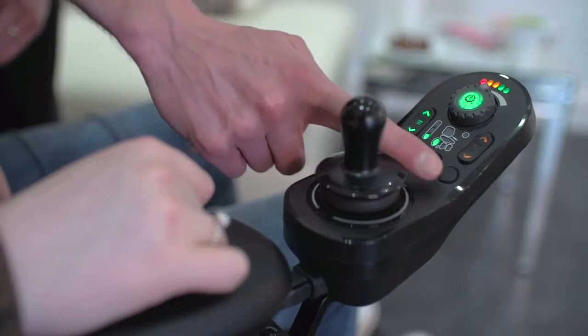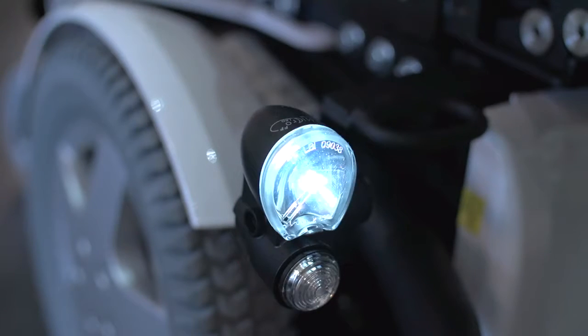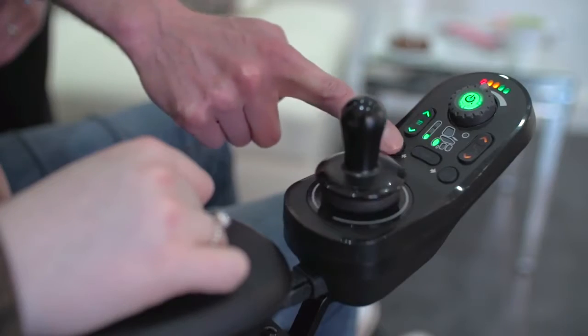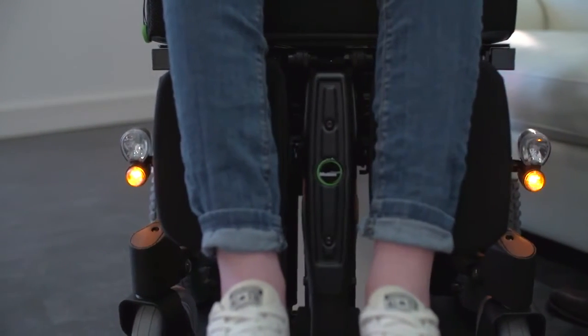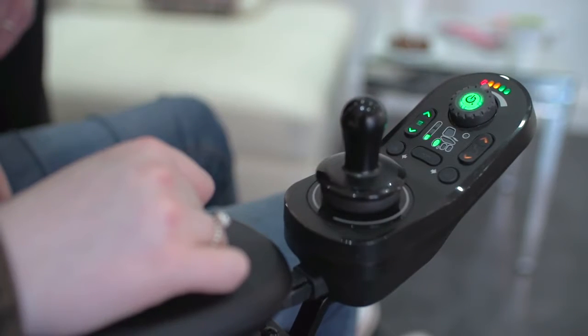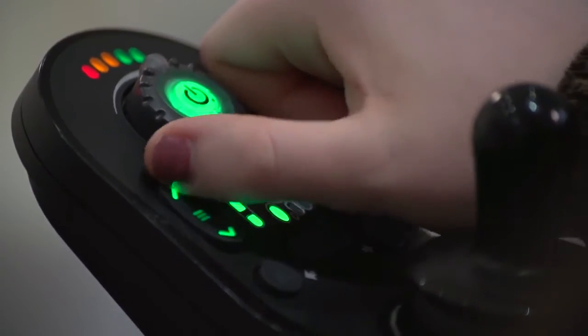For lighting, a short press on the right-hand side button activates the side lights and a long press on the right-hand side button activates the right indicator. A short press on the left-hand side button activates the hazard lights and a long press on the left-hand side button activates the left indicator. A quick press turns off the last function. The lights have been designed so the more frequently used functions are quicker to access.